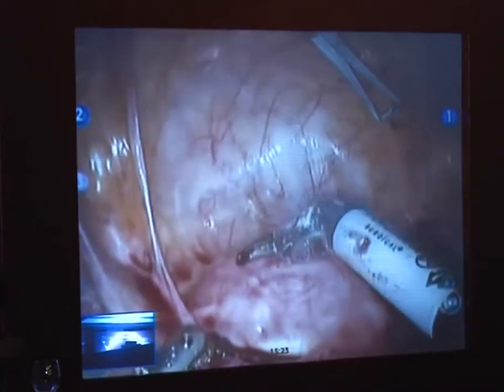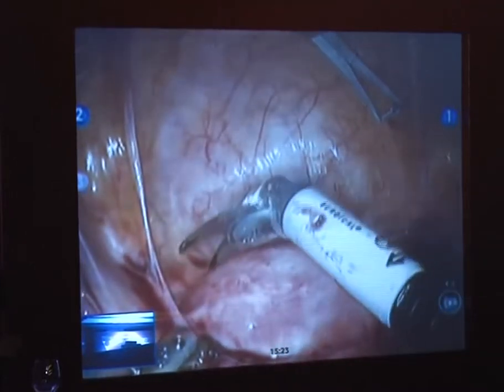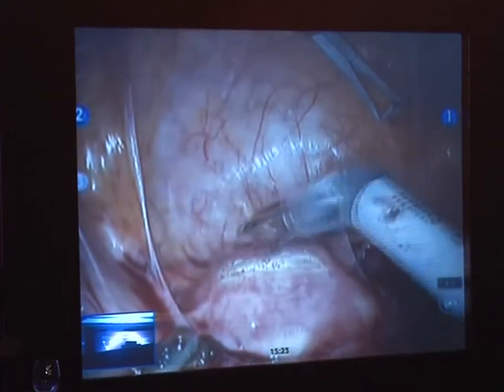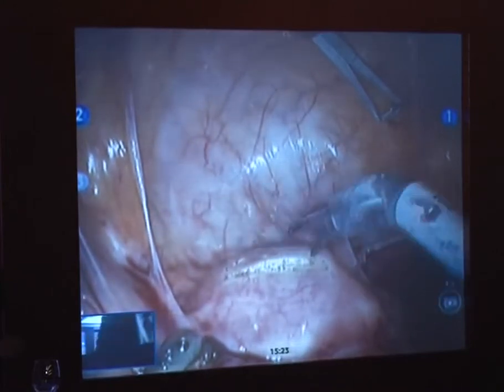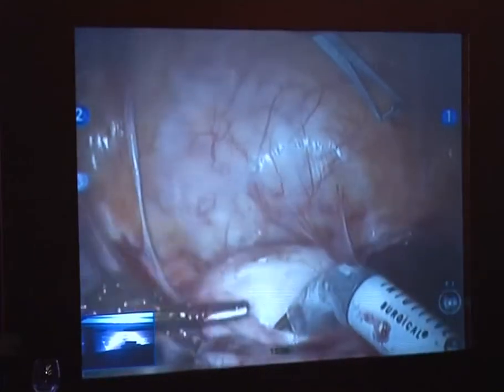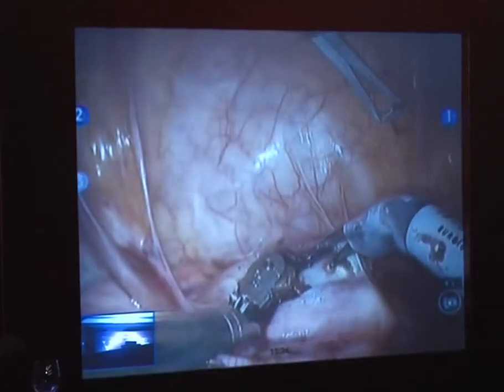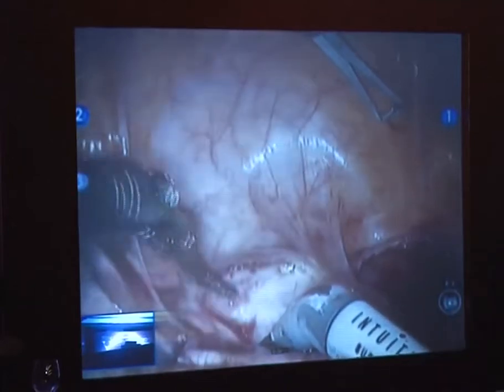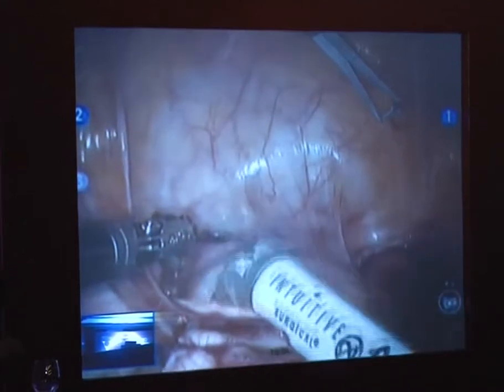Yeah, there we go. Such muscle memory, I keep wanting to push the pedals on the inside. And no, I can't do that. The tenaculum is probably one of the most scary instruments on the robot platform. If you're not aware where it is at all times, it's got such a wide jaw opening that you're not sure where it's at. You can get into a world of trouble quickly.